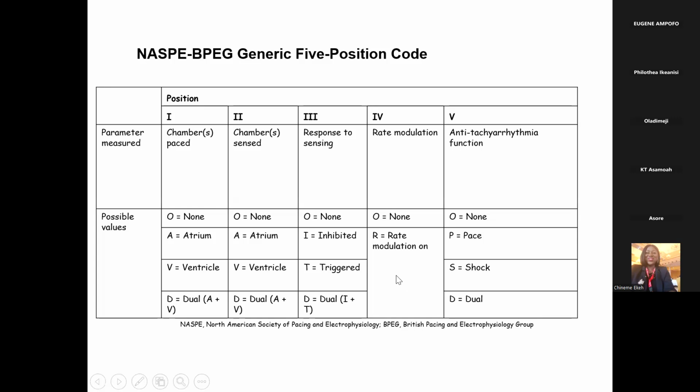So if your pacemaker does not have an upper rate limit, let's say pacemaker rate is just 60 beats per minute, by the time the patient is running at a rate of 100 beats, 120 beats, the patient will soon have syncope because the programmed heart rate cannot cope with the current activity the patient is doing. So that's why you always need to turn on this rate modulation, especially in young, middle-aged people that still do very strenuous physical activity. So their rate limit should be turned on.